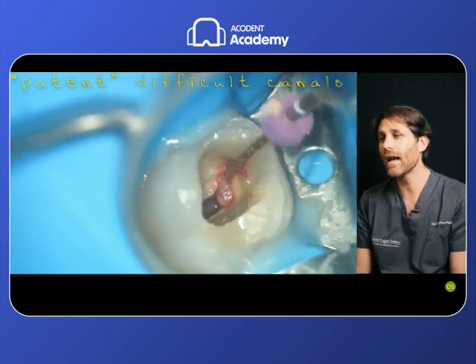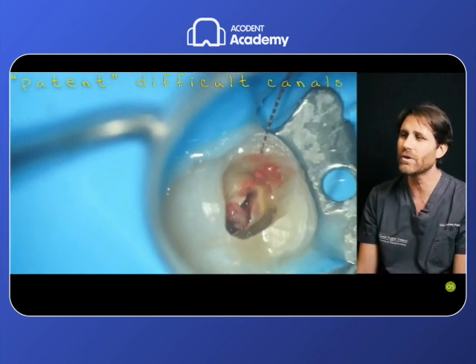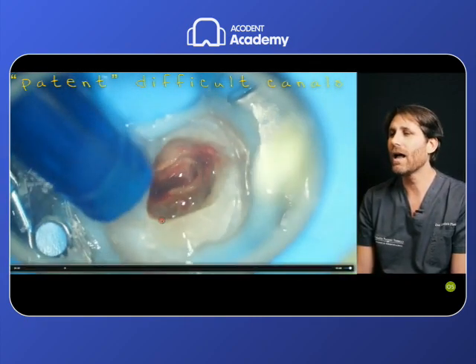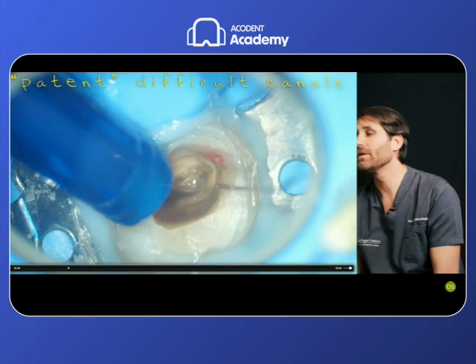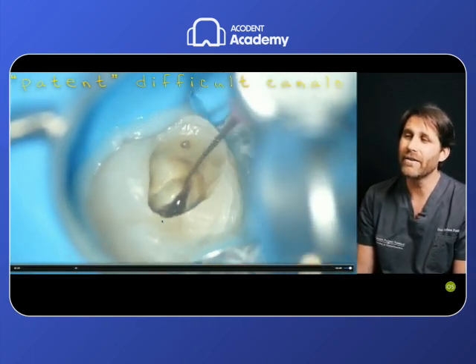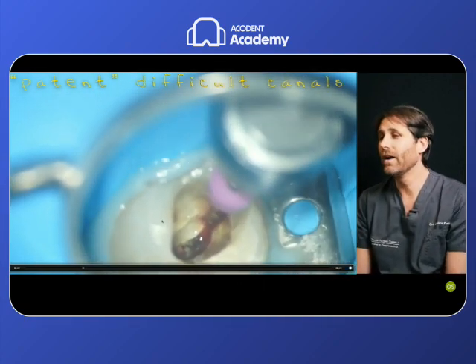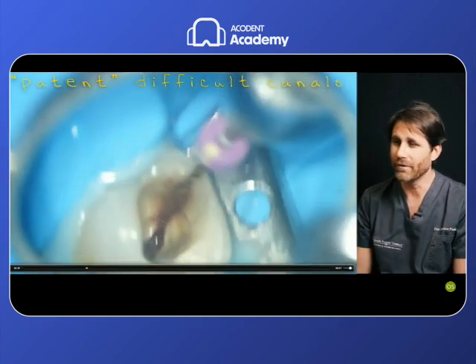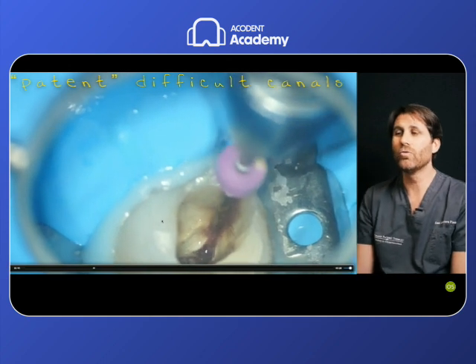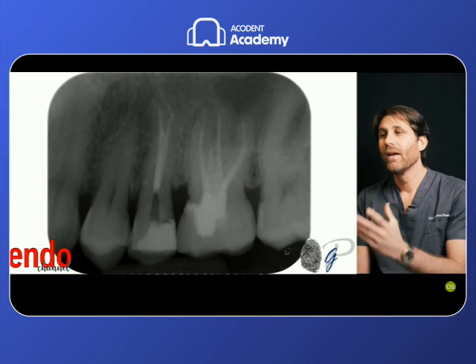Look, without any scouting, even in this case, it was a patent root canal, even if difficult because of the curvature. But we could treat this patent root canal thanks to the properties of these files. So normal standard cases can also be treated with files with other properties. But the most difficult root canals were really difficult to be treated by other files other than the one that I suggested. This is another case.